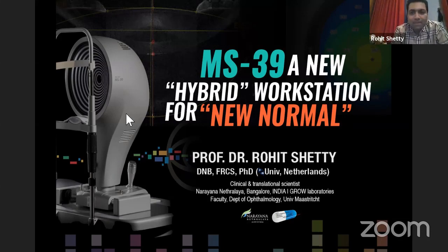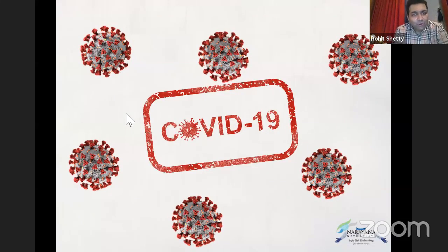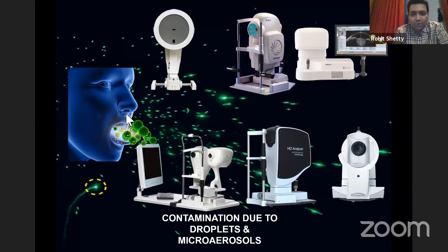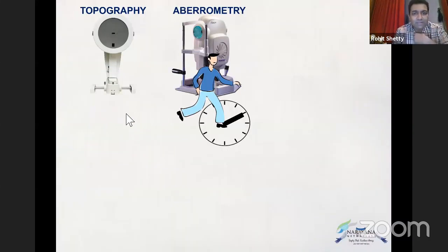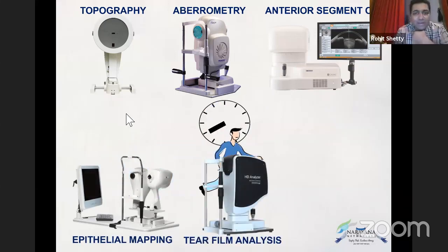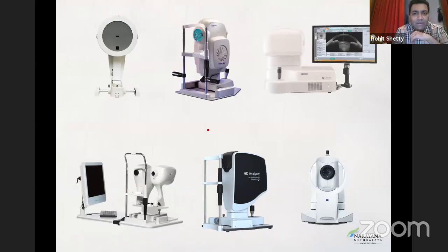Thank you, and thanks to the CSO for this opportunity. These are my financial disclosures. I have nothing specific to declare today. These are COVID times. I'm sure a lot of you are worried about many things, aerosols, and going back to your practice. One of the major issues when you're using multiple tools is always contamination: how these aerosols or droplets contaminate your tools. As refractive cataract surgeons, we are now forced to use multiple tools for different things, from epithelial mapping to topographies and everything. So my talk is, in this new normal, how do we use one instead of all these things?